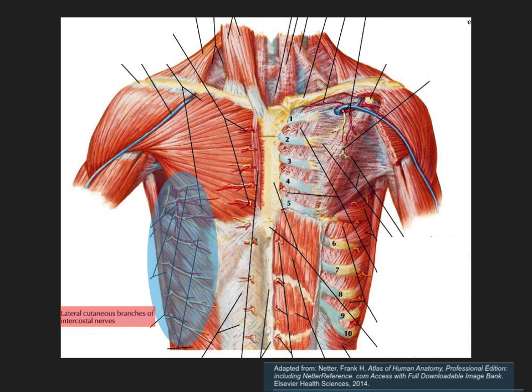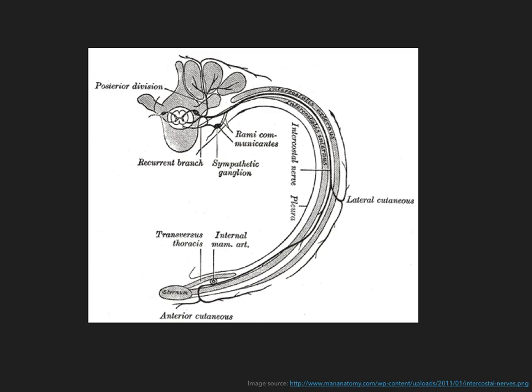As previously mentioned, the best anesthesia is obtained from T2 to T9. This block also seems to work best for lateral and anterior rib fractures more so than posterior. In this axial view, you can see the intercostal nerves coursing out from the spinal cord, then perforating through the intercostal and serratus muscles laterally and branching within our plane of interest. Again, our anesthetic is outlined in blue where it will spread in the plane.